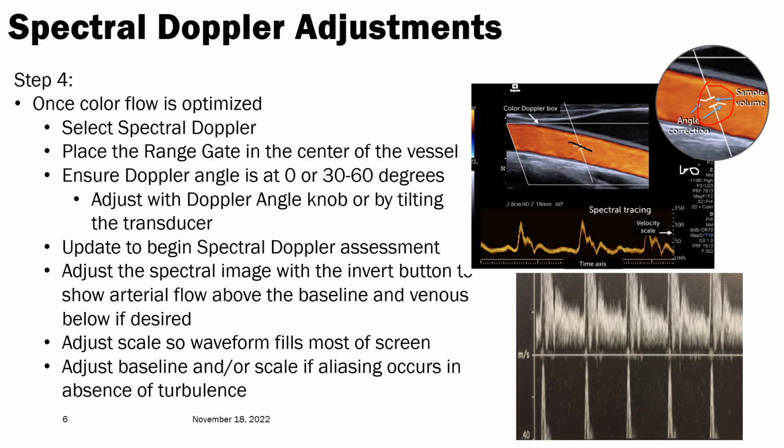And so here you see on this image, we're getting a nice tracing of the velocity of this artery, and we can look at this velocity and say, okay, we have a good systolic upstroke, meaning that blood is being moved forward through the system with ease, without a lot of resistance. And then during diastole, the speed of that blood flow is going to taper off, but it never comes to a complete stop because it maintains above the baseline.